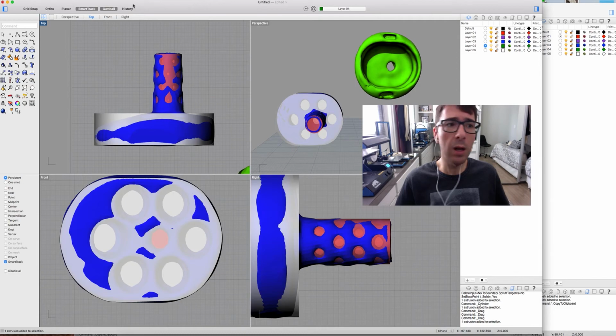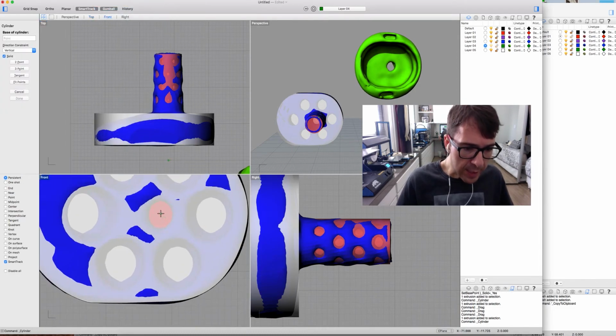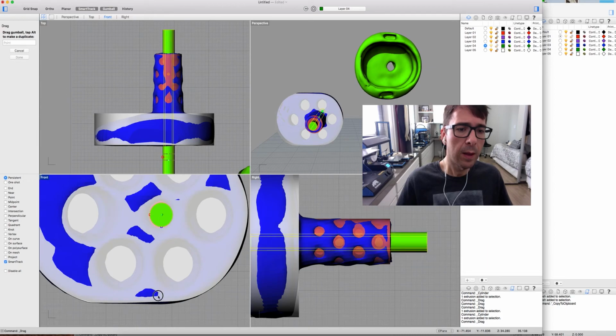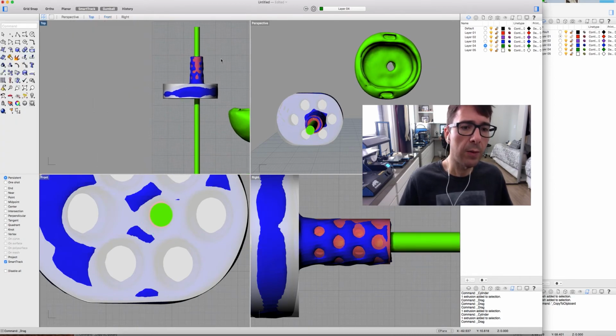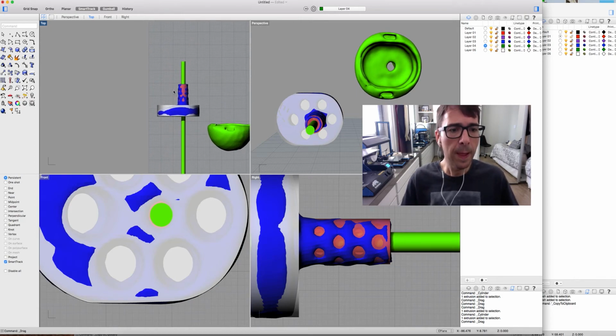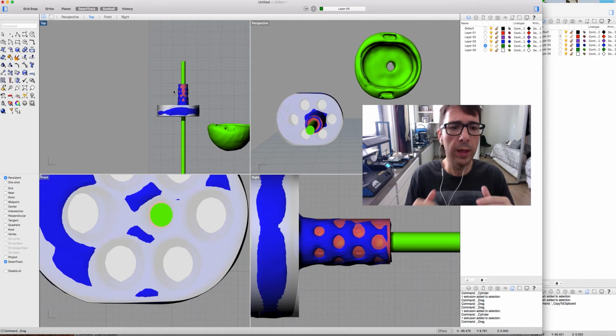Let's change the color to green. Solid, cylinder, a cylinder just in the middle. Okay, so I overclicked. Here we have our central pin guide. Okay, we are almost done. Now we could cut the implant in order to be just as the original.